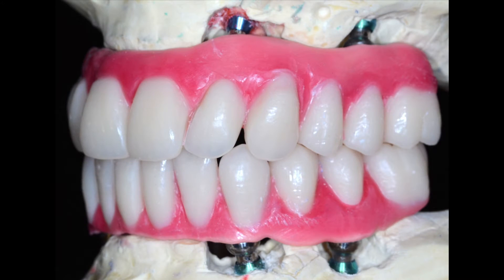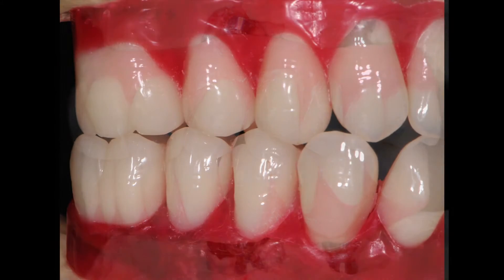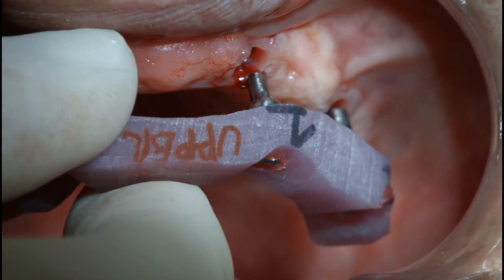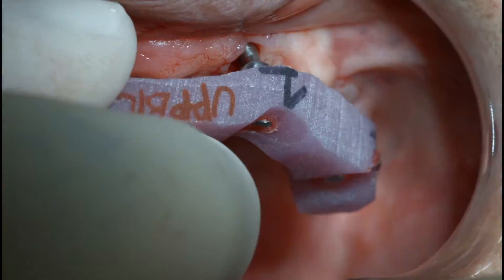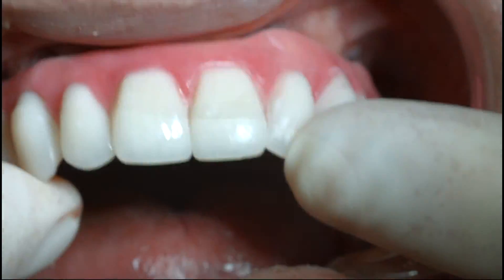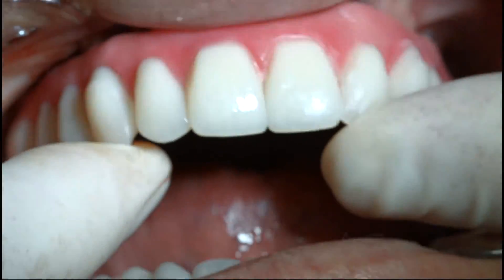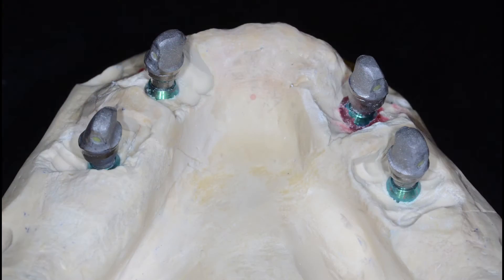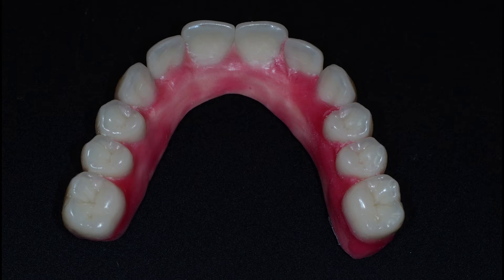Preliminary wax teeth arrangements were achieved with Candulor composite teeth on light-cured resin bars over the milled parallel abutments. During the second clinical visit, intraoral confirmation of the milled abutments and wax teeth arrangements was facilitated with the use of the light-cured resin jigs. After confirming the appropriateness of the teeth arrangements, the milled abutments and wax teeth arrangements were returned to the dental technician.